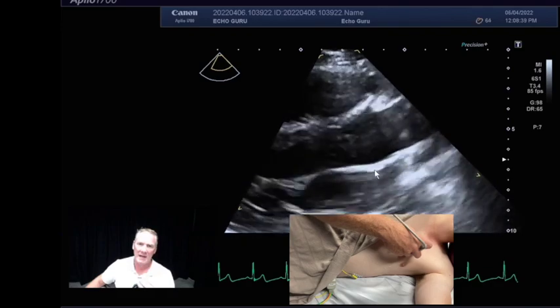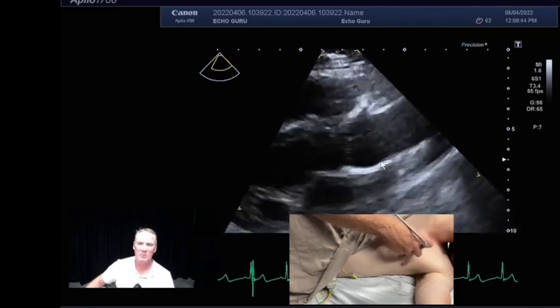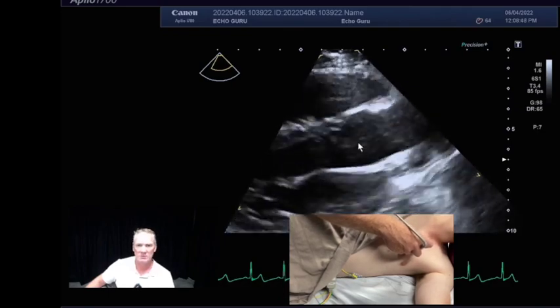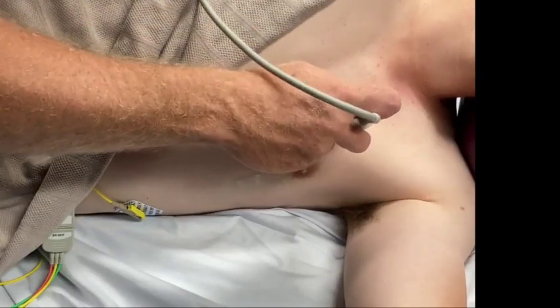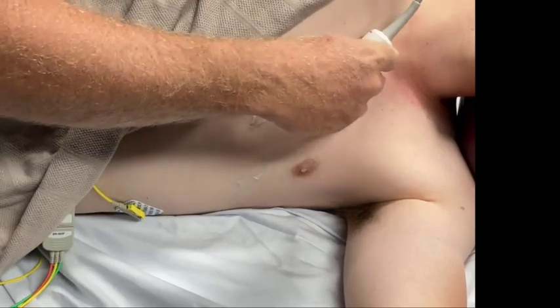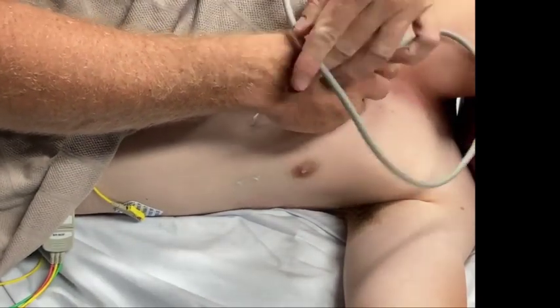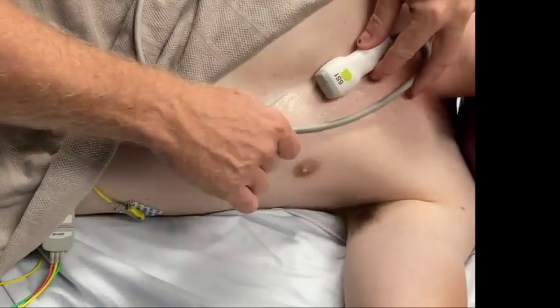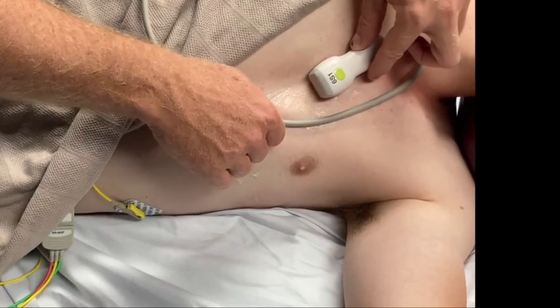The aorta at the aortic valve is fixed, and that's because it's essentially tied in by the pulmonary veins, which don't allow the heart to move much at this point. And so if we do dilate the heart, this point still stays in the same spot. Now if we have a look on the chest wall from where I've got my transducer here, the aorta is going to start coming up across through here, and we can see the angle that it's going through on the chest wall. It then does a U-turn up at the aortic arch, which is the tail of this transducer, and is going to wrap around back down behind the heart and sits in this plane through here.